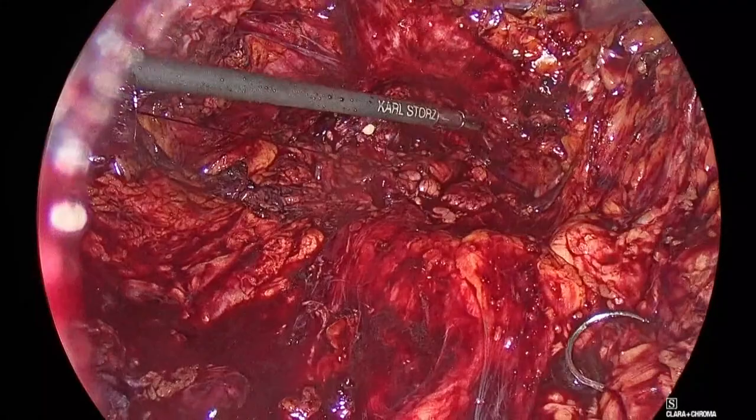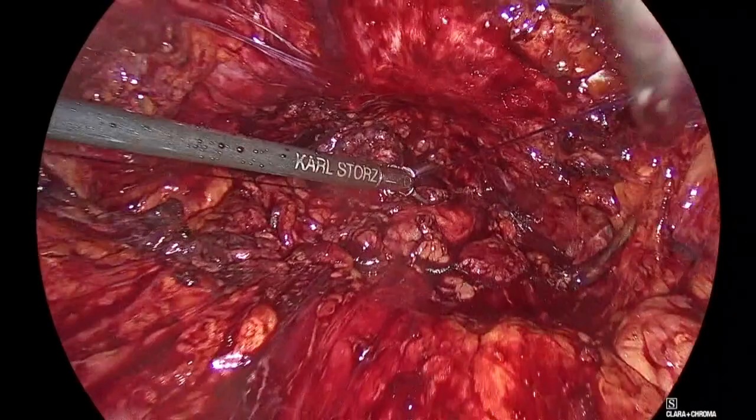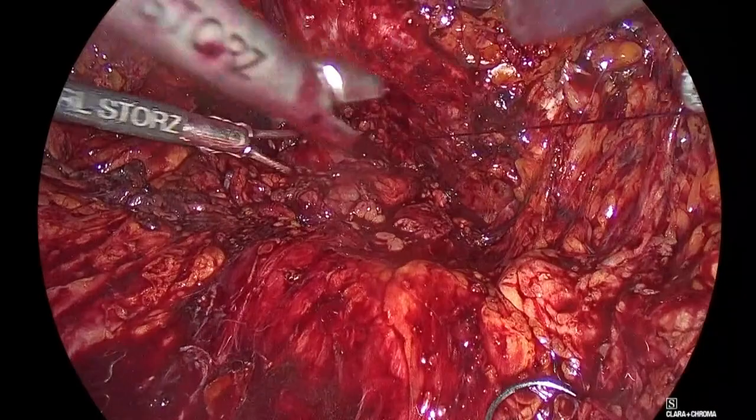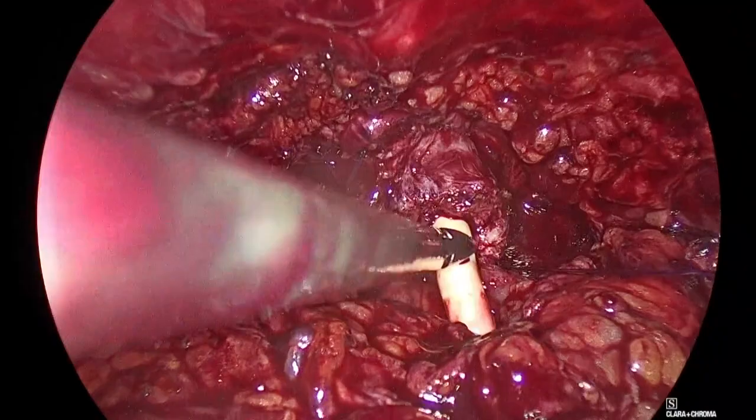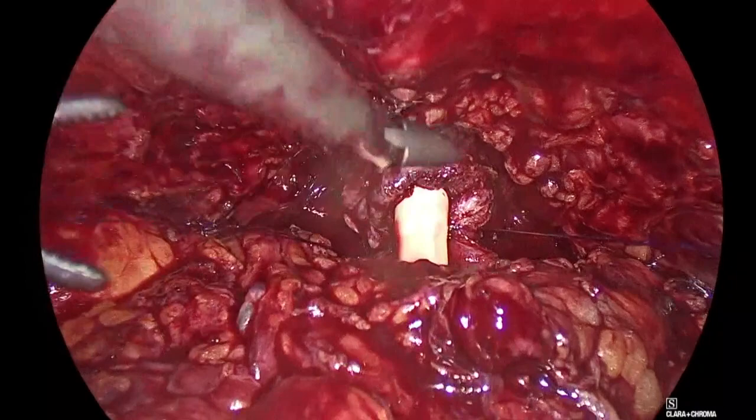Show me, Padeli. Panagiotis, go back, Padeli. Hold it back here. Good. In your trocar. Good. Put the catheter in, please. Padeli, come in. Wait. Is this a Timon catheter? We want a silicone normal catheter afterwards, huh? 18 normal. Okay, put the whole thing in. Push it in. In. All.